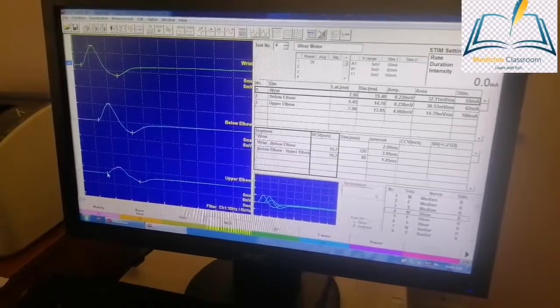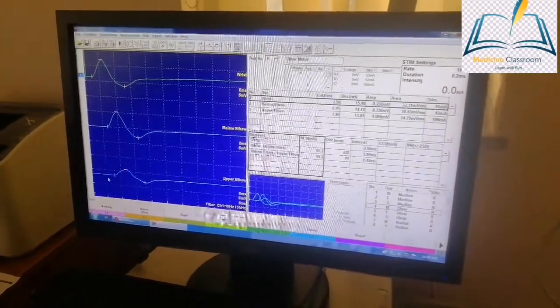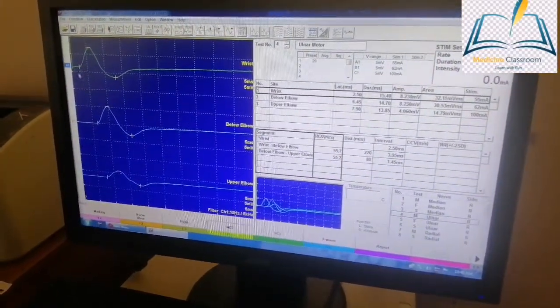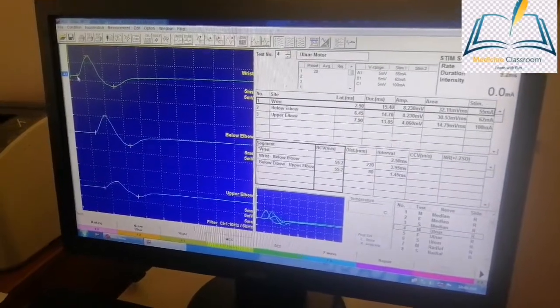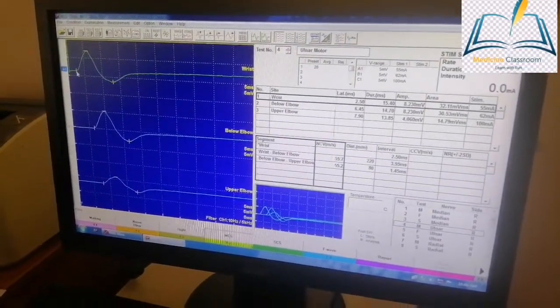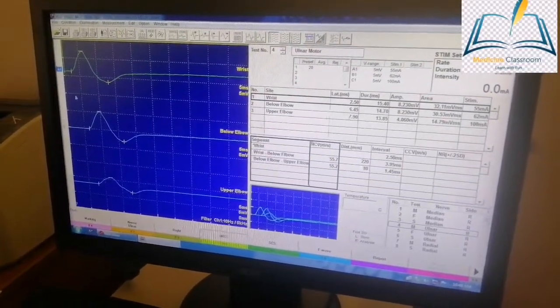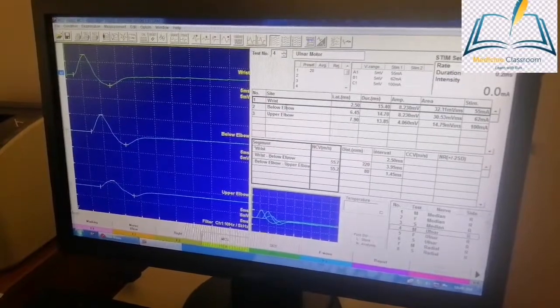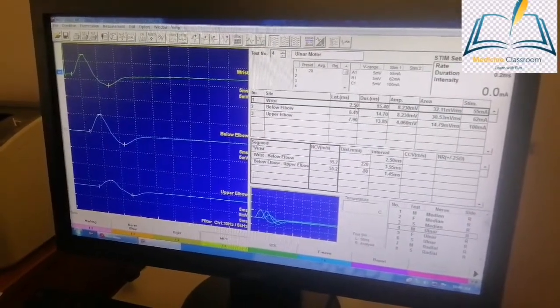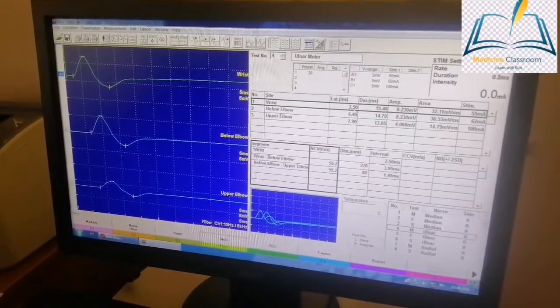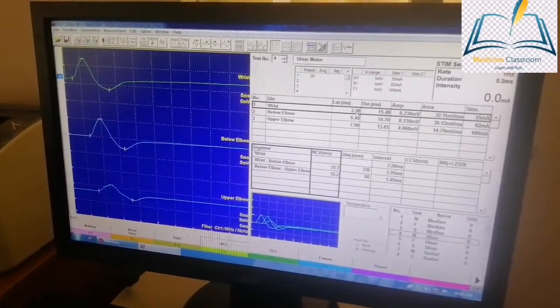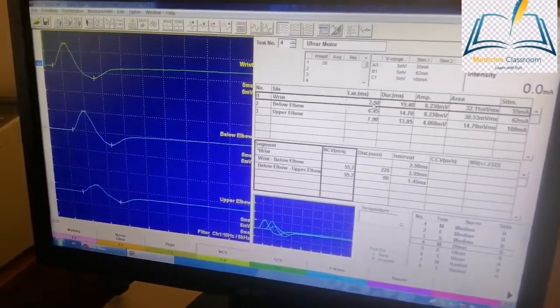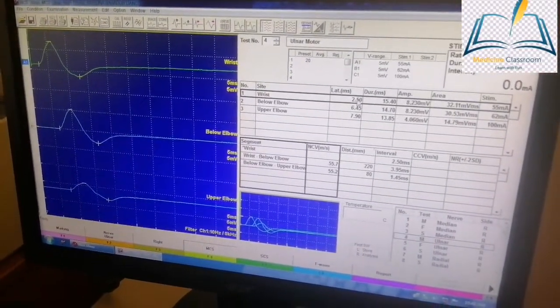Let us analyze. Distal latency is from stimulus to the onset of the motor unit action potential. You can see here it is 2.5. We usually take if the distal latency is less than 3.3 milliseconds then it's usually normal. So in this patient, distal latency seems normal.